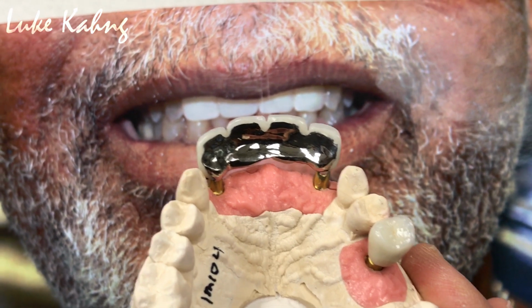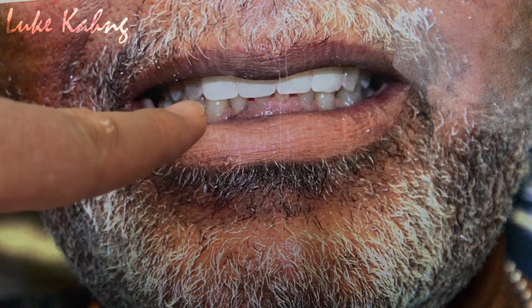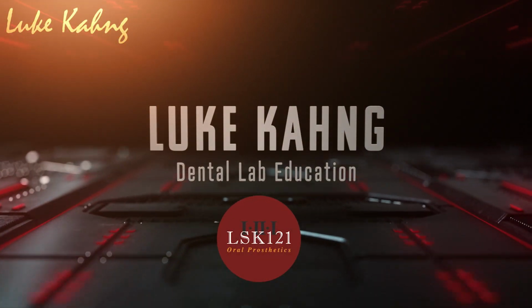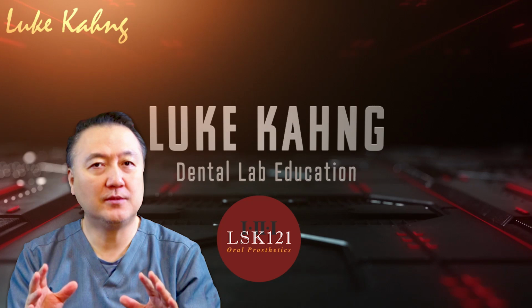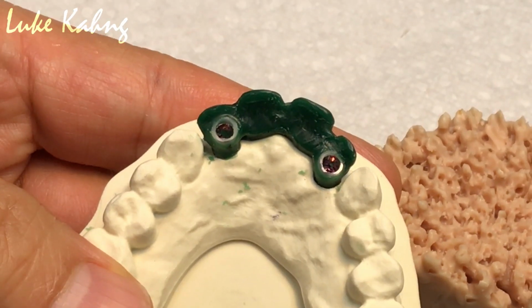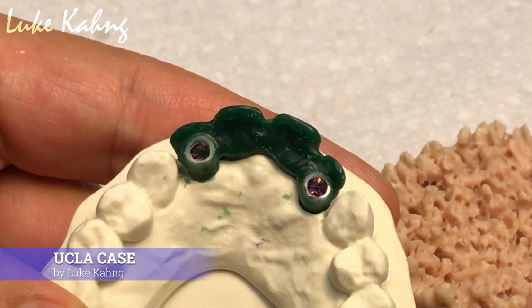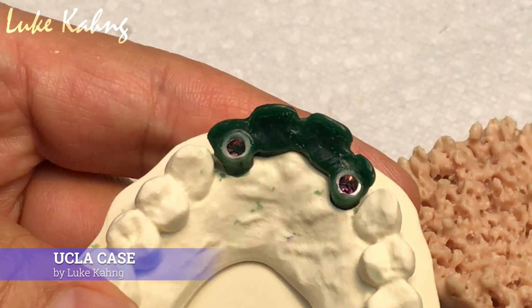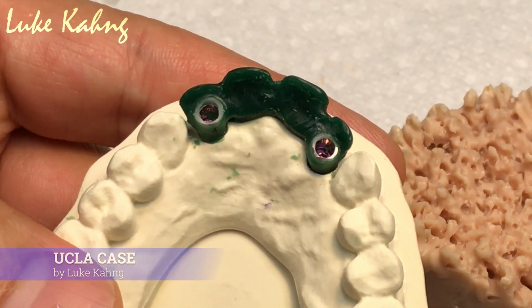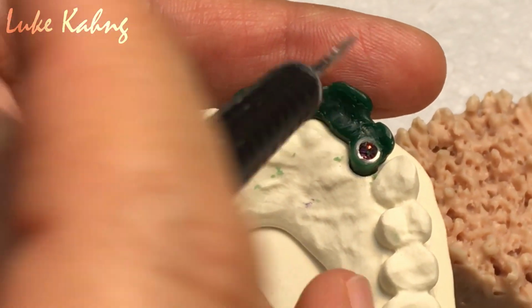Guys, we finished a drawer of cases for this gentleman, and then I have a tough case with UCLA. Yeah, so we're going to casting. Is this semi or wide? Semi, okay. So what I see, number one, I know we can cut it, we can shape it down later.